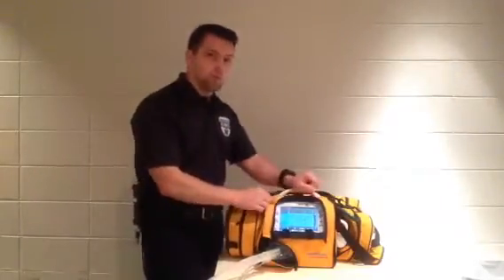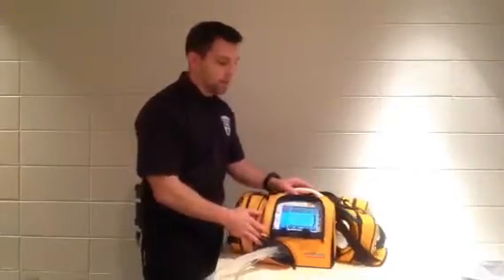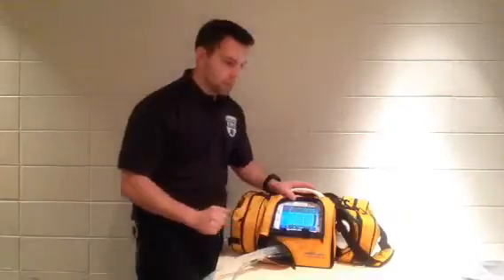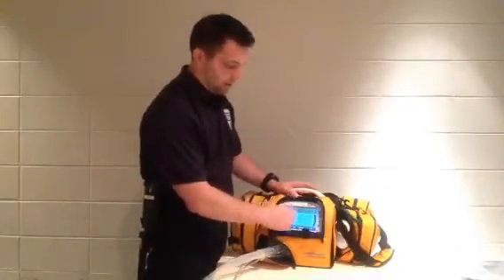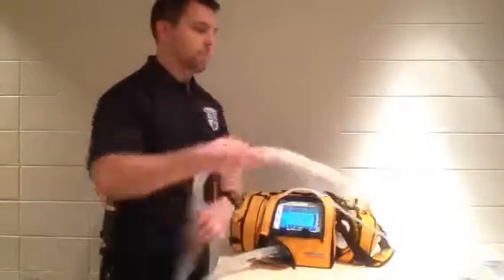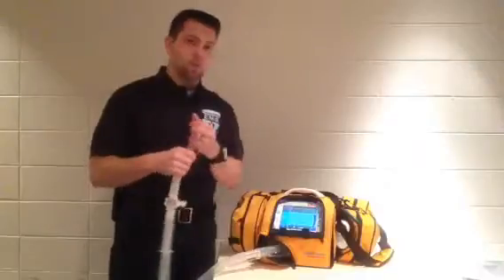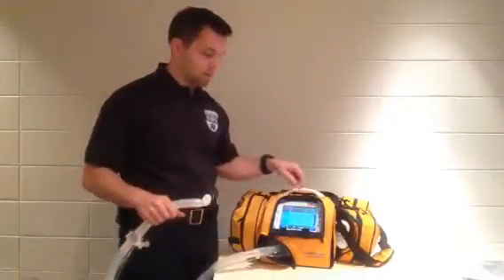One nice feature is when you turn this ventilator on it always brings up the last settings from your previous ventilation session. That's a nice feature since from patient to patient most ventilator settings are pretty similar. You can immediately select start ventilation at those settings or you can do a circuit check. A circuit check is recommended and very simply it's just checking to make sure that you don't have any leaks — it's going to pressurize the line and then go through a self system check.